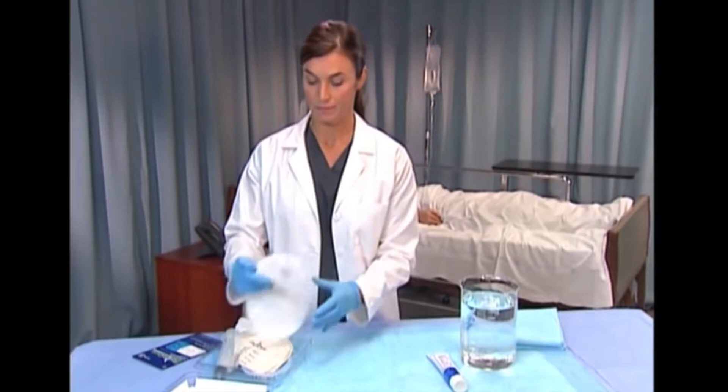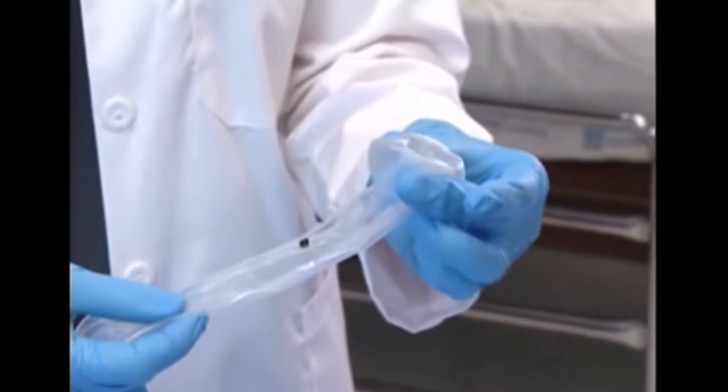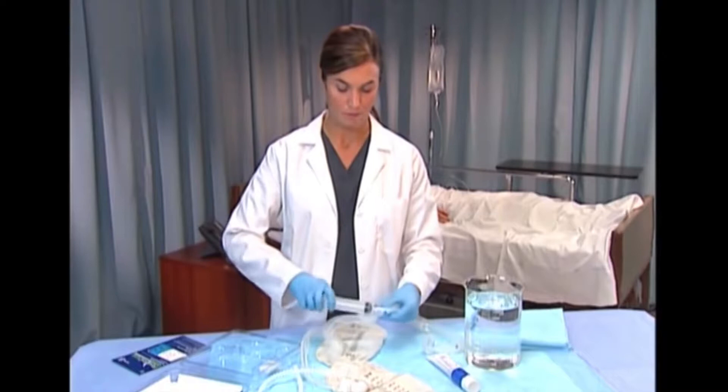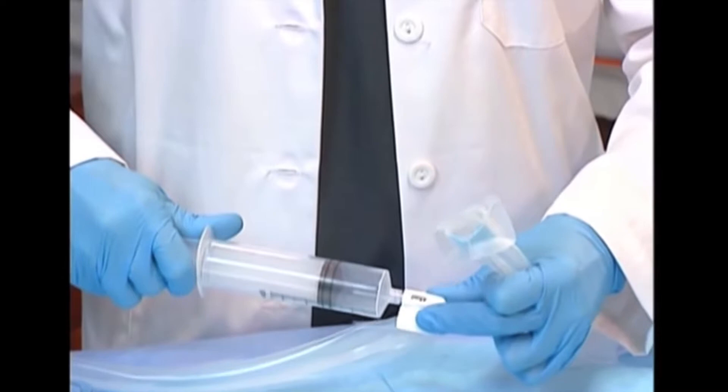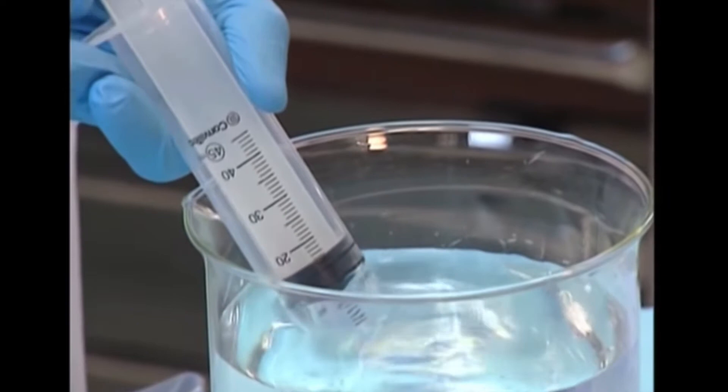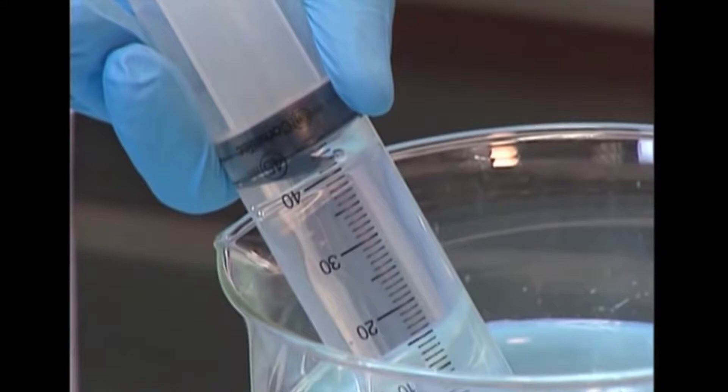When removing the device from its packaging, check to see if there is any residual air in the balloon. If so, remove it by attaching the syringe provided to the inflation port and withdrawing the plunger. Prior to filling with water, ensure that the syringe is empty by expelling any air. Next, fill the syringe with 45 ml of tap water or saline and attach it to the white inflation port. Do not overfill beyond 45 ml.